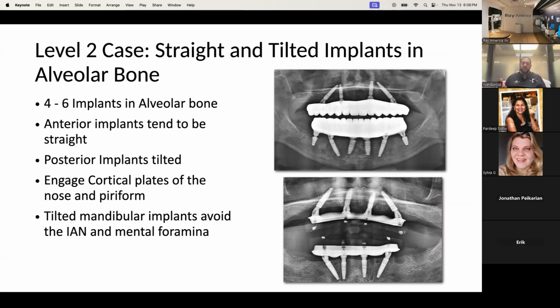But you can accomplish tremendous things with this approach because in areas in maxilla and mandible where there's not as much room, you can tilt implants and have almost the same amount of AP spread on your case as putting 6 implants in straight, but you can do that with only 4 implants tilted. These do tend to be longer implants because we're tilting away, and so we have more room to run the apex of our implant into solid bone.